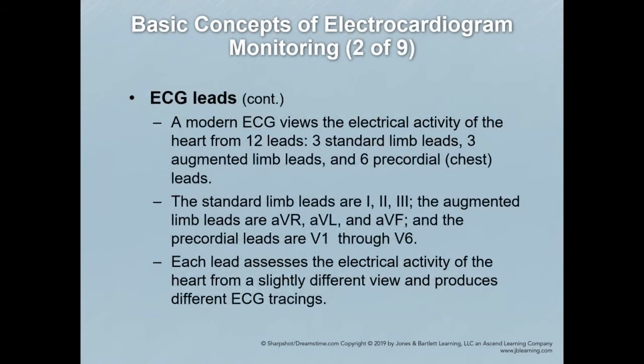So basically we refer to it as a 3-lead, okay? And the 3-lead is the standard from your limb leads. You'll hear people refer to it sometimes as a 4-lead because we now have a limb lead for all 4 limbs. And if you're in the ER or in-hospital setting, you'll see a 5th lead placed in the center of the chest. However, we're still getting the same views. We're just dealing with a variation in current to obtain those views to make them a little more accurate.